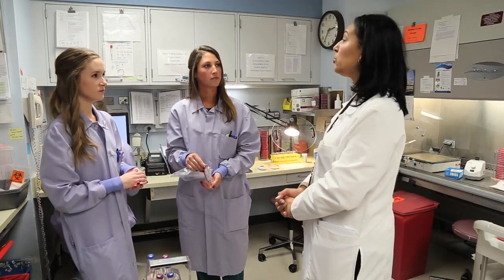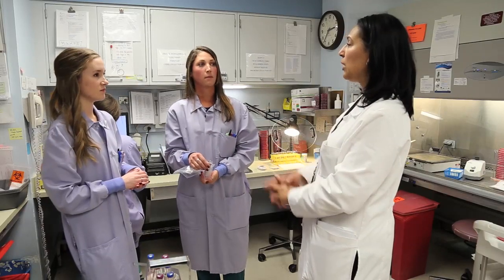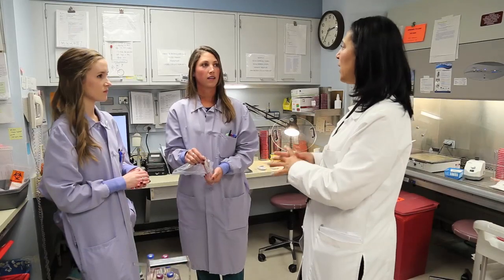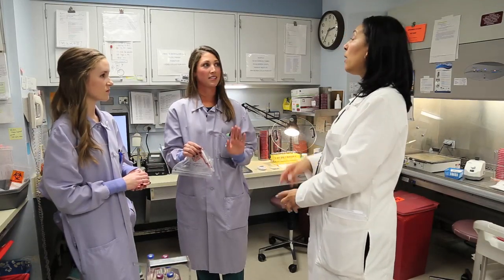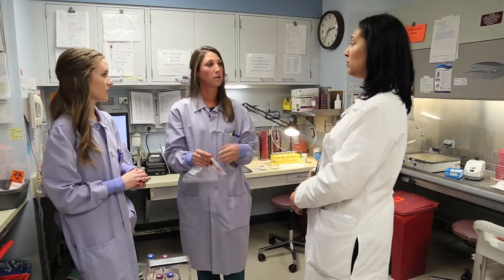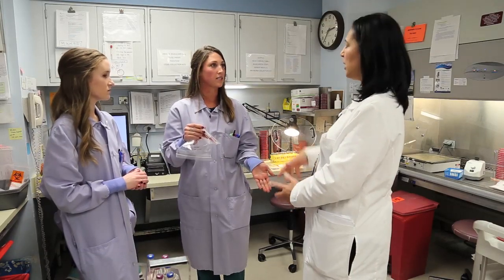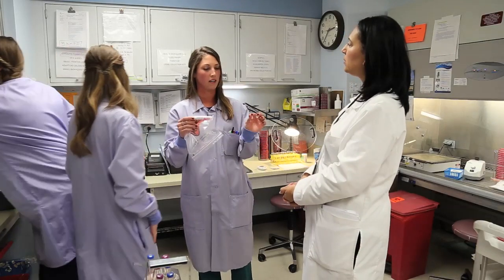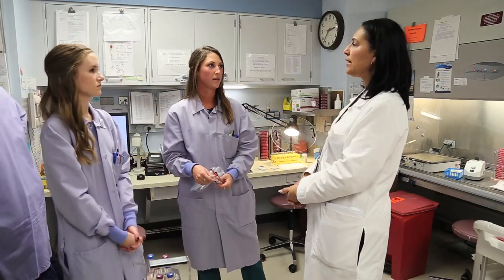What about in a syringe? Yes, that's good. Can you just recap the syringe and then put it in a bag? As long as the needle's been removed. We wouldn't use a needle. There are some people taking aspirates of things, and it'll come down with the cap back on. But if we see the needle underneath it, we won't touch it. We won't accept it. The needle has to be removed.